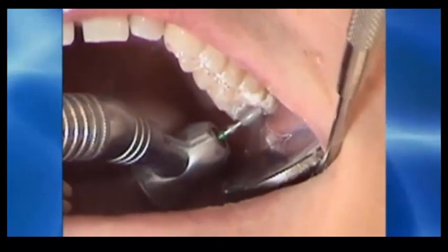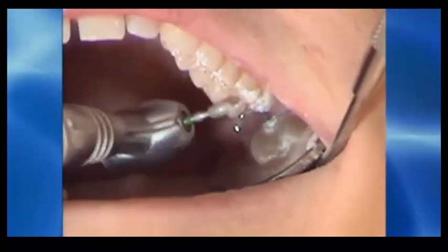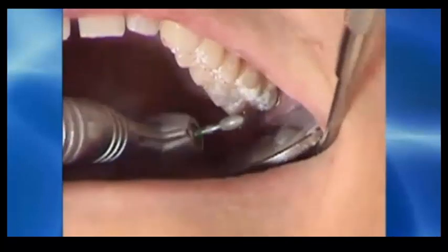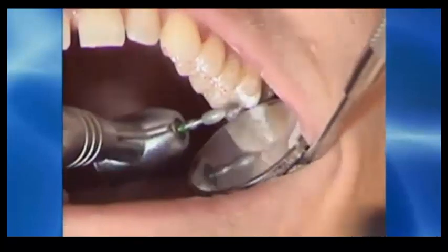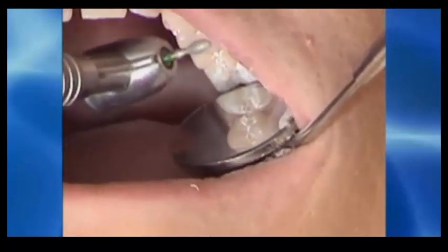I'm just touching the teeth, removing small lace-like marks that the T-scan shows to be long disclusion time. And for some of you that may be an adjustment in your own thought process, because a lot of the marks that we're treating are very small, lace-like and scratch-like.